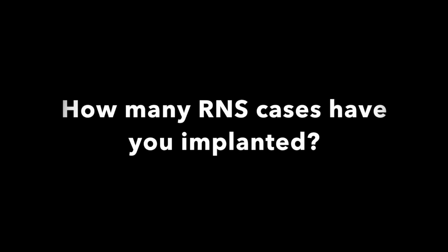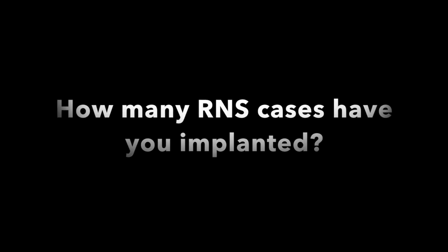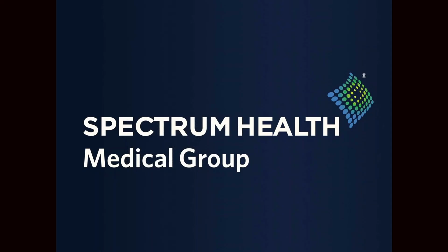Any other questions? Yeah. We've done about 20, roughly 20 so far. Yeah, we tend to have a population here that have already gone through surgery and then they end up getting referred to us and they've had 1 or 2 or 3 resections, and most of these patients aren't good resection candidates, so they end up having an SEEG type evaluation followed by an RNS.